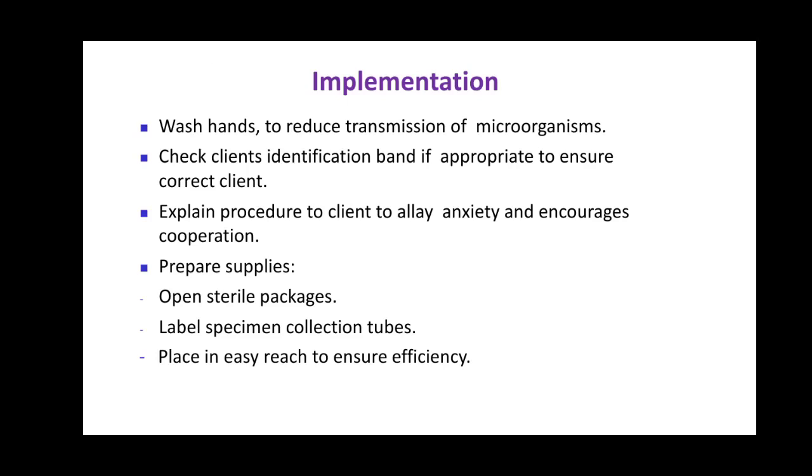So here are some implementations to be taken care of in the lab while collecting the specimen. First, wash hands to reduce the transmission of microorganisms through hands. One has to check the client's identification, if appropriate, to ensure the correct client, and explain the procedure to the client to allay anxiety and encourage cooperation. And prepare supplies like opening sterile packages, labeling specimen collection tubes, and placing them within easy reach to ensure efficiency. So these are the precautions or implementations to be taken care of while collecting the sample.